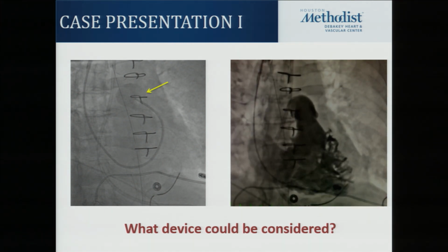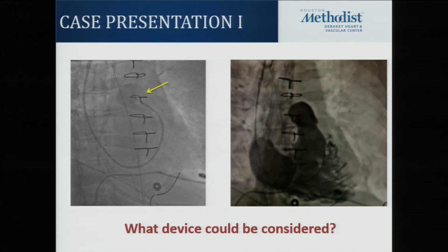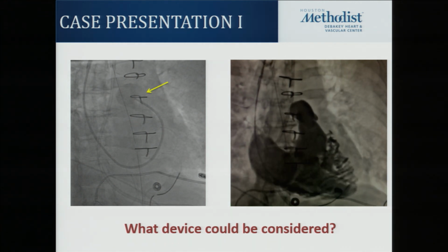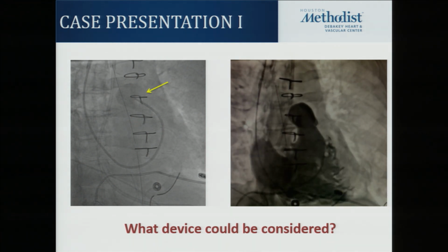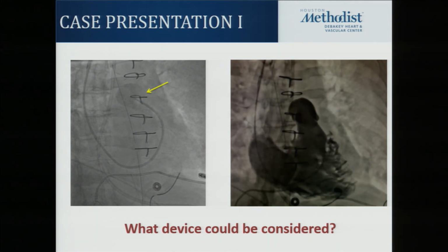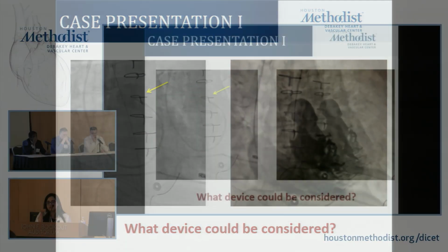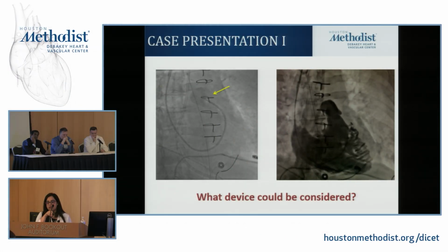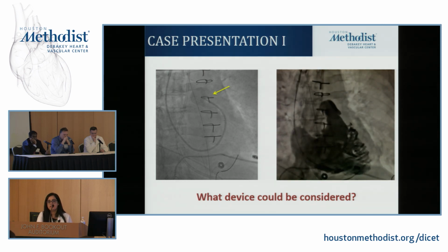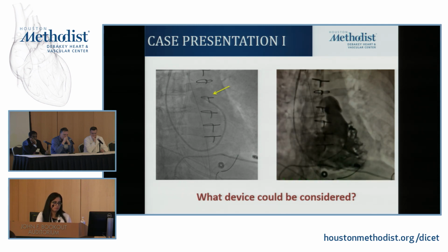And that's why we were seeing an underfilled left ventricle. The echo was deceiving here because we saw all the blood being sent back into the right atrium, and we were seeing PA systolic pressures in the 80s. And if we had gone by the echo, we would have completely missed this diagnosis. And so from the cath lab, like Dr. MacGillivray said, the patient went to the OR, and they tried to remove that clot, but unfortunately she had HIT, and her prognosis, being in shock for that while, was poor to begin with.